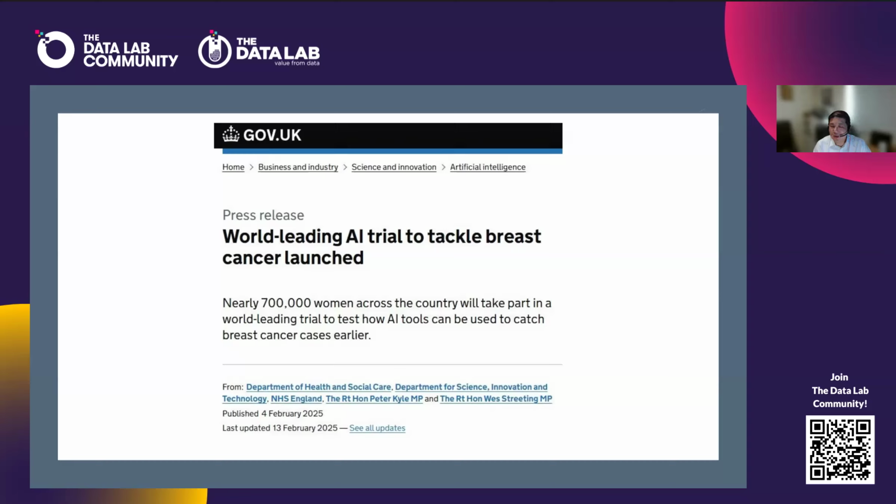What's different is that if you look at the previous studies, they're all one AI and one center. Whereas here, we're trying to do 4 or 5 at least different AI companies across a central platform, because I think this is the pragmatic future approach where you're going to have multiple different AIs and you're going to have to see which one works well for your population. An AI that works well in Aberdeen may not work as well in London, which has a different mix of ethnicity, a different sort of grouping of people. So this trial has been launched. We are going to start the IT and information governance and data protection and all that kind of paperwork. That actually takes a long time, unfortunately.